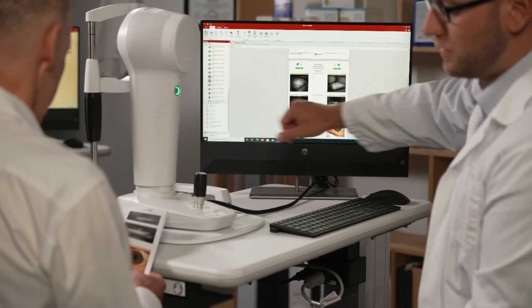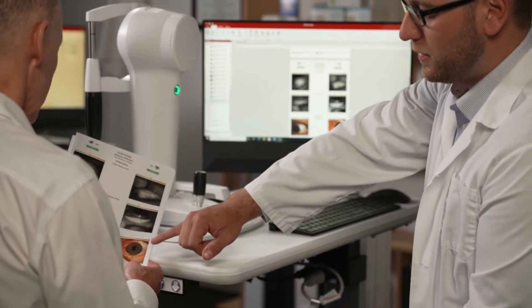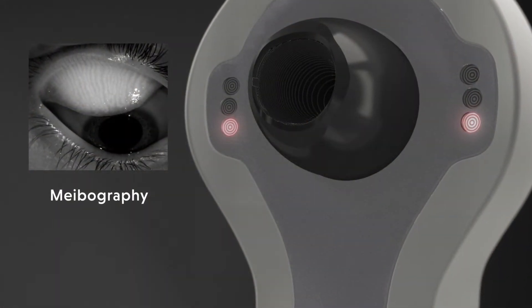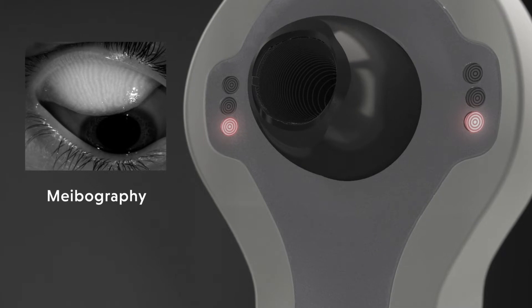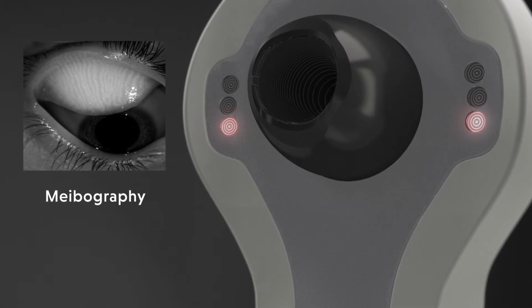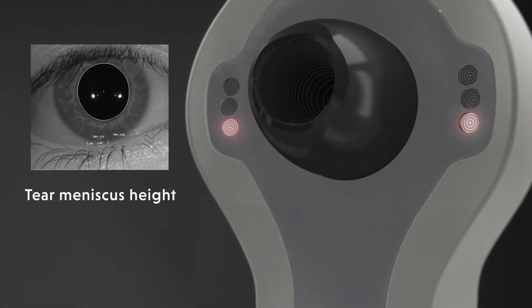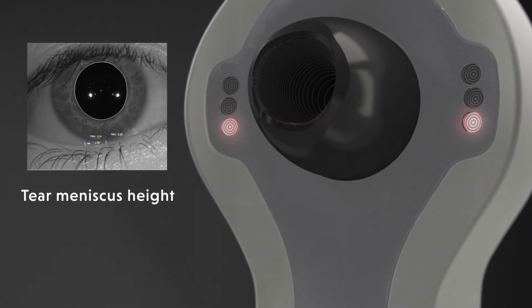Another very valuable dry eye assessment feature is the infrared meibography that your Medmont Meridia can perform. This provides a very clear picture of the gland health, and infrared imaging can also be used to measure the tear meniscus height.